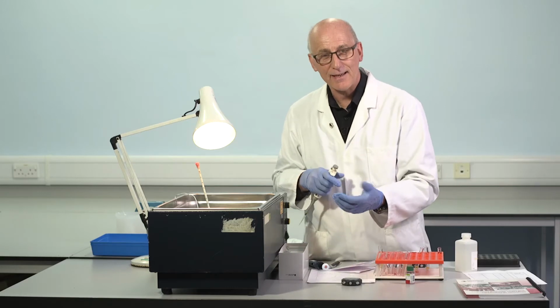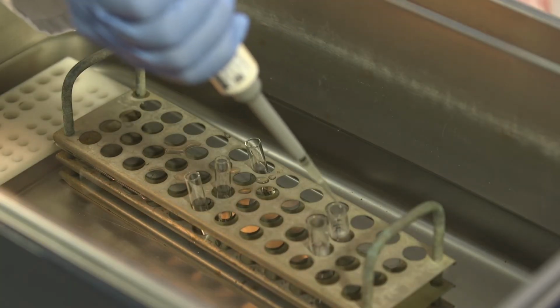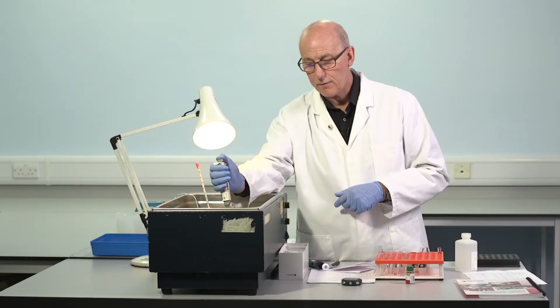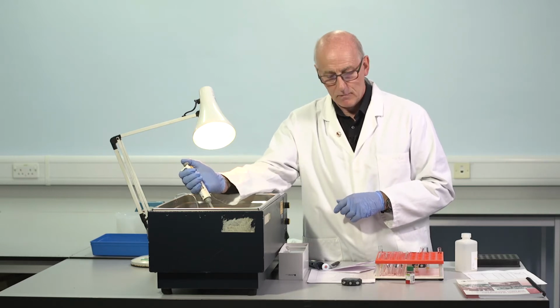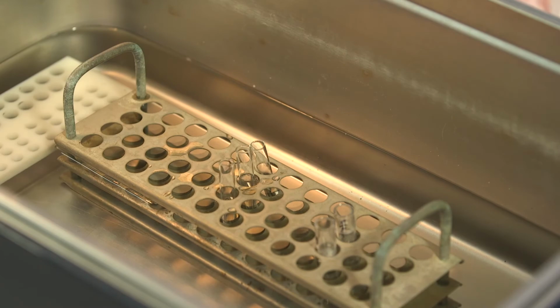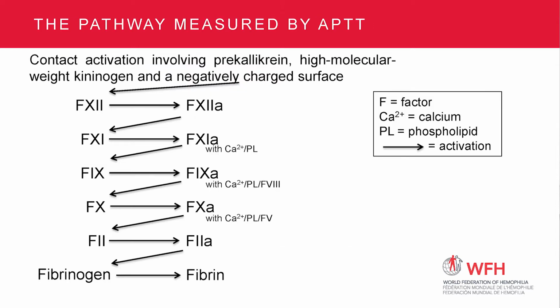APTT reagent contains activator, contains phospholipid. At 15 seconds to the second tube and mix. At 30 seconds to the third tube and mix. So during this stage, APTT reagent, contact activation, 12 to 12A, 11 to 11A, practically no calcium present, so no further at the moment. The longer the activation period just now, the more 11A, the more 12A, the more 11A we generate. So this needs to be carefully timed.